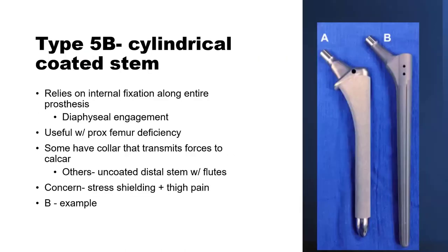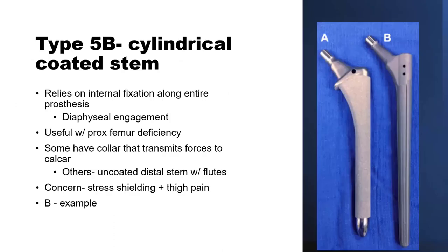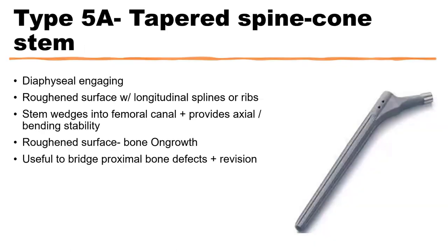Okay. And again, there are different types of designs to the stems, one where you have these spline/cone stems versus it being cylindrical. Is there anything that would make you choose one or the other, or is it just preference? Yeah, what you're familiar with using, but they both can be used in similar situations.